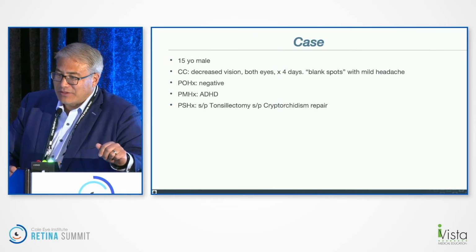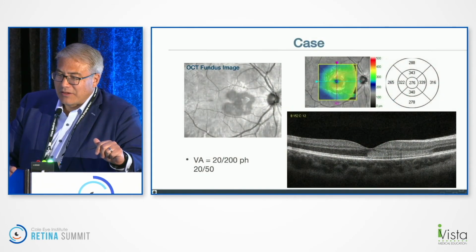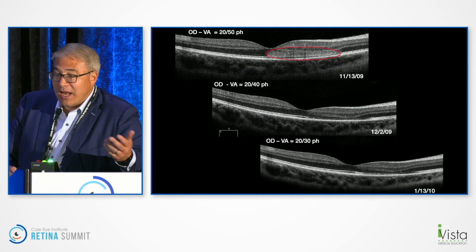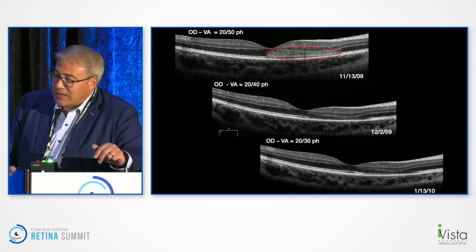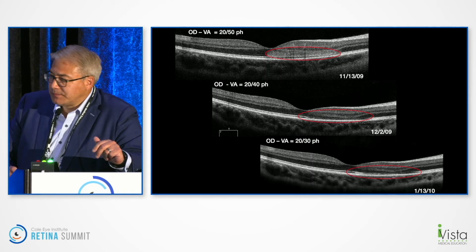15-year-old male, decrease in vision, ADHD. The mom thinks he's BSing, that he has this decrease in vision. Laser. Laser. Very quick, very easy. And here you get to see over time the patient's getting better. But this is just one of those where once you see that pattern, you don't miss it. And we had a great talk on this today already. And was he on medications for the ADHD? He was. Yep.